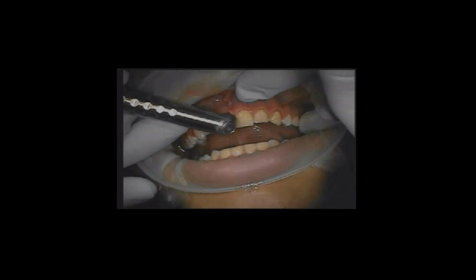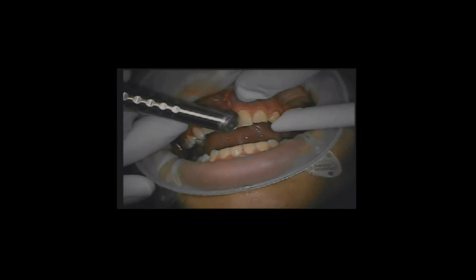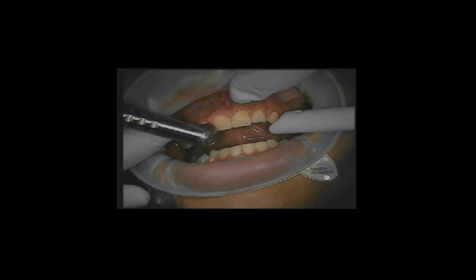So what I'm doing now, the tipless handpiece works really nice to get rid of that bulky papilla, that bulbous type of papilla that's in the interproximal. And again, it can also be used to do some final beveling as well.